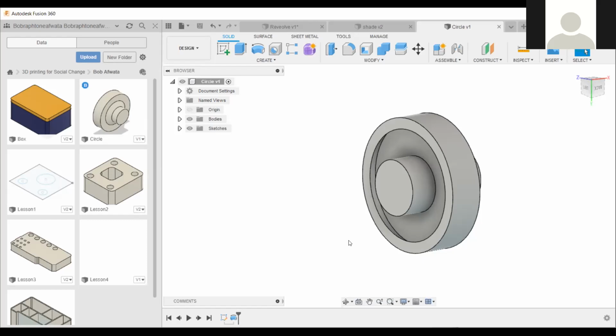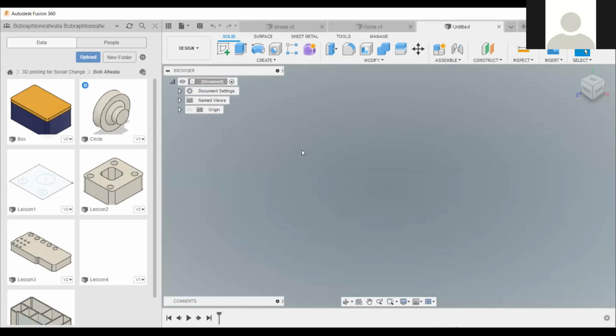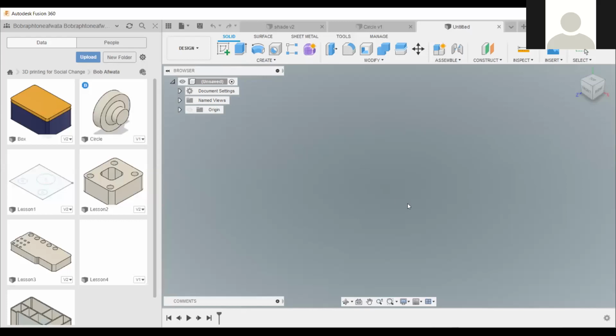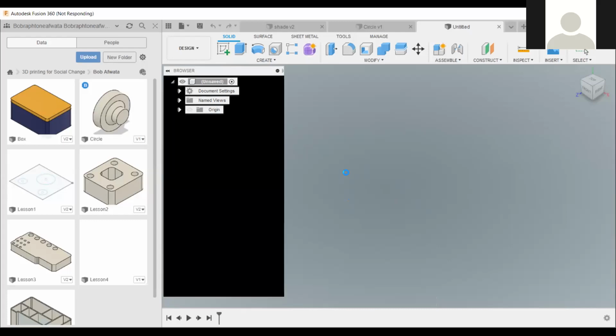Okay, guys, let's do the last thing, then we call it a day. So you know now how to revolve. I want to show you the next one. So just create a new project. You just do Control N. So I want you to call it medical. Or let's say, I don't know, device. Just call it device.